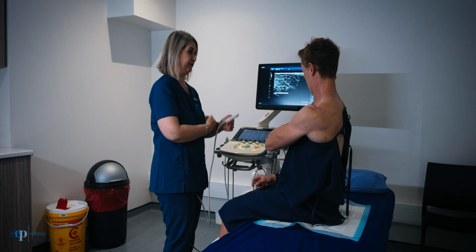Typically, the kind of specialist we'd work with would be an orthopedic doctor or a sports medicine physician and the ER doctor. And the structures that we'd look for are the soft tissues that are critical around a joint. A common injury is a ligamentous injury, and the ultrasound is a powerful tool to assess the ligaments.